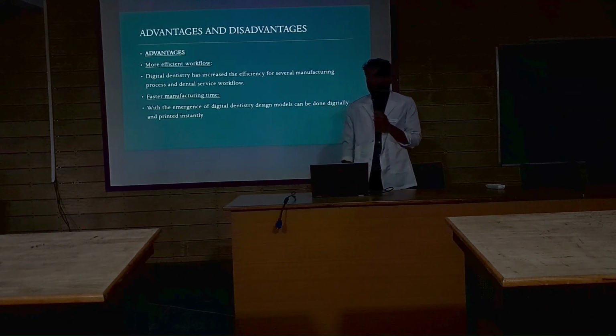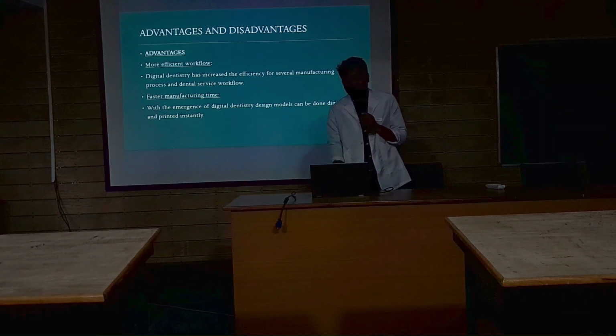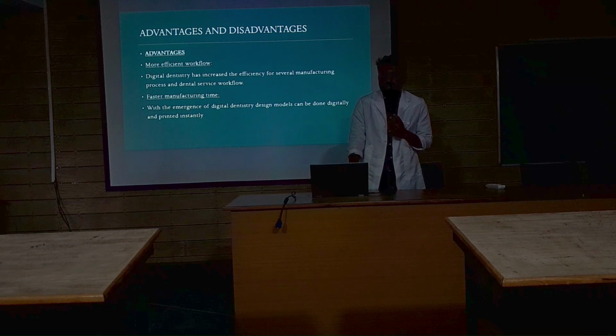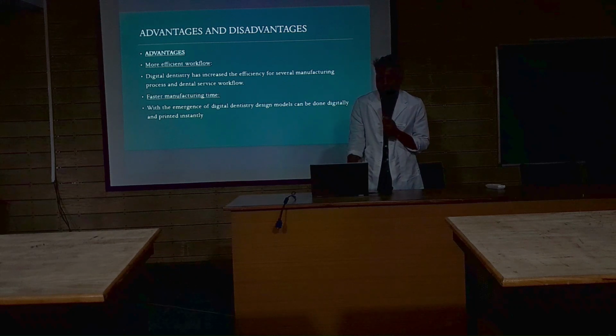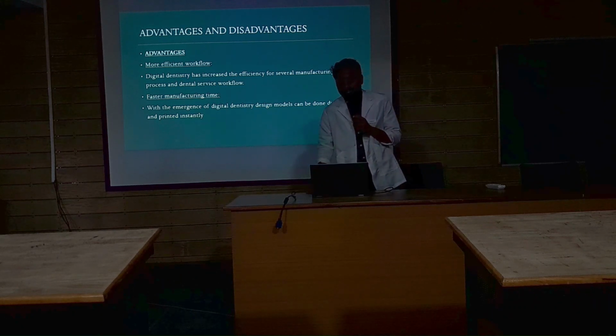So we come to advantages and disadvantages. What are the advantages of digitalization in dentistry? We have a more efficient workflow. Digital dentistry has increased the efficiency of several manufacturing processes and dental service workflows. Then faster manufacturing time. With the emergence of digital dentistry, design models can be made digitally and printed instantly.